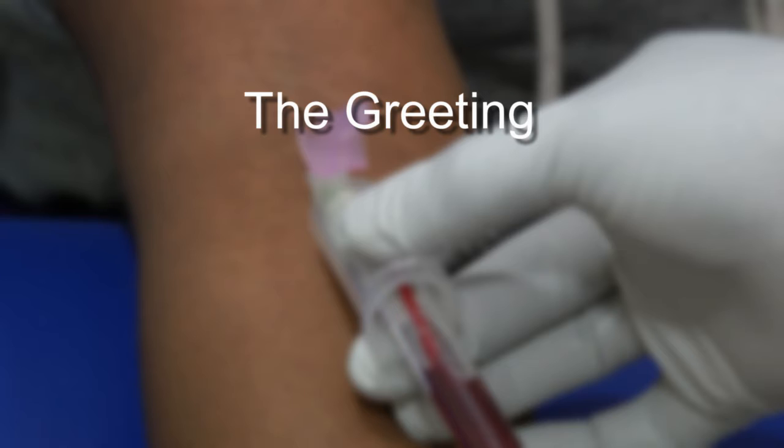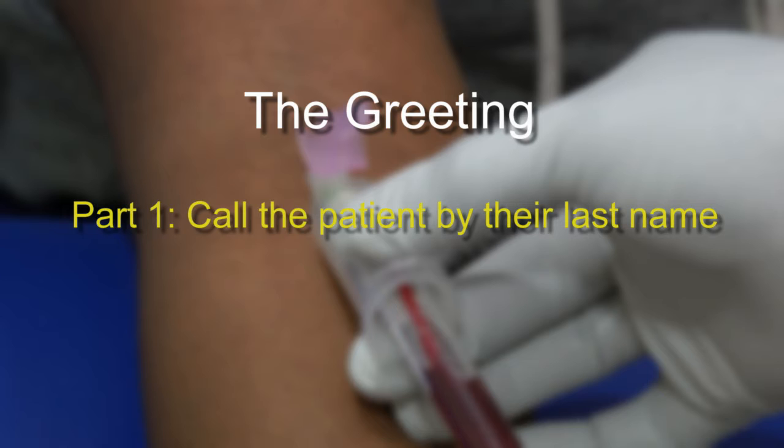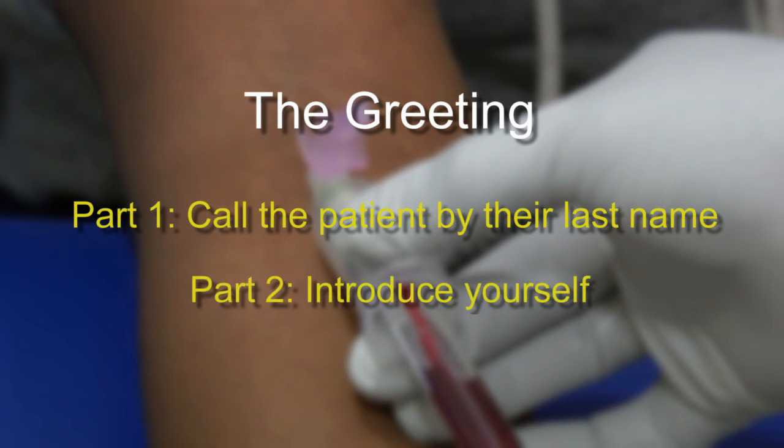The greeting. Proper greeting technique will build a solid rapport between you and the patient and falls into two parts. First part is calling the patient by their last name. The second part is the introduction. For example, "Hello, Mr. Smith. My name is Anthony, and I will be your phlebotomist today."